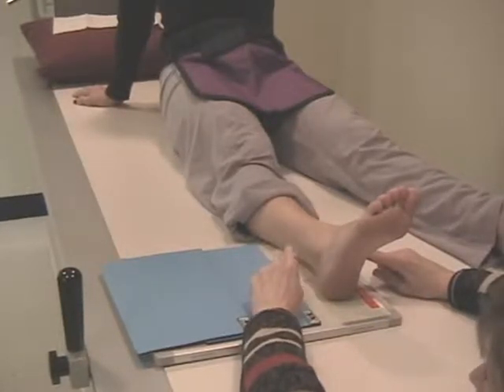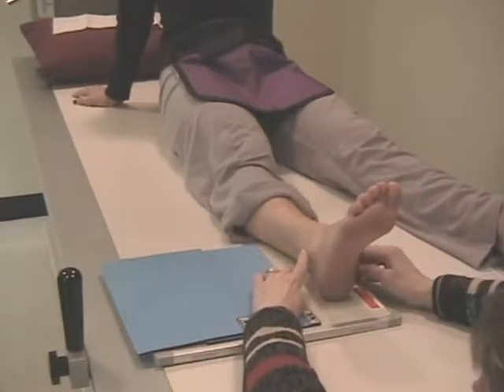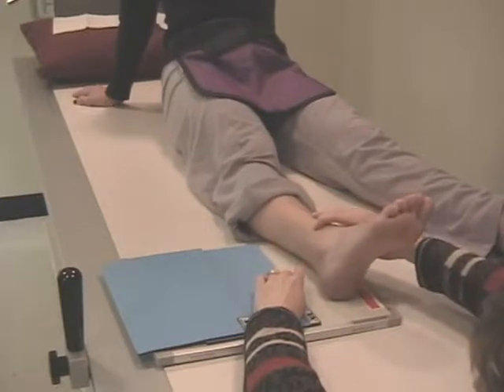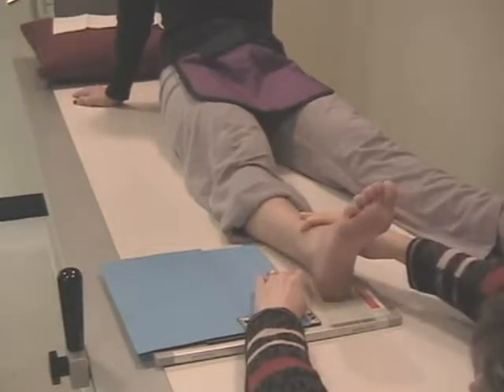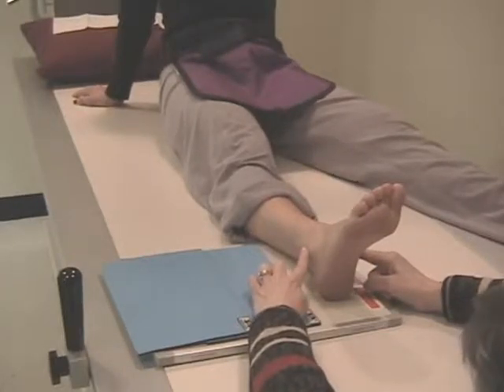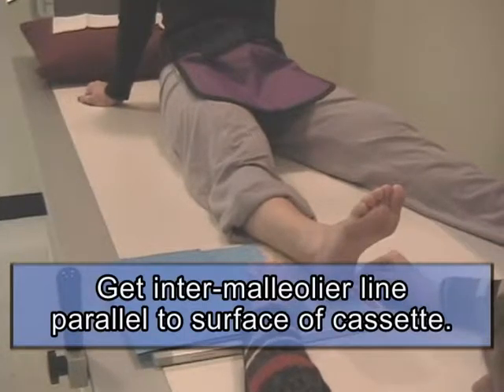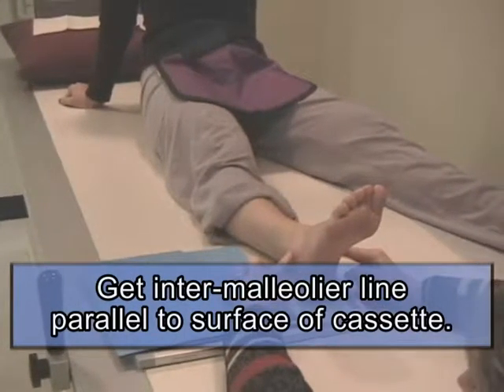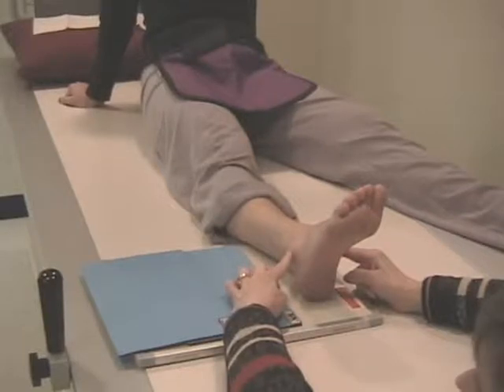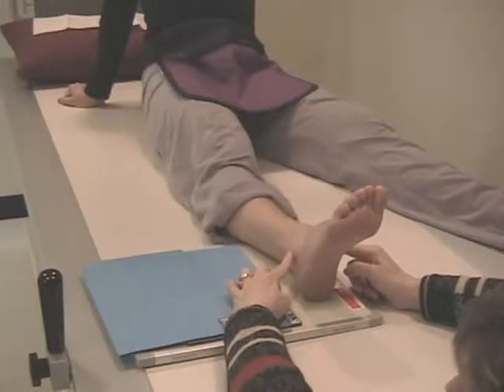Another patient might only be a 5 degree. And another patient may be a 20 degree. So if you come to the end of your table and you examine the malleoli and you get the intermalleolar line parallel to the surface of the cassette, you will have that AP mortise, and that mortise joint will be a beautiful projection, and hopefully you will be able to get the foot flexed enough to open up the talotibial joint better.